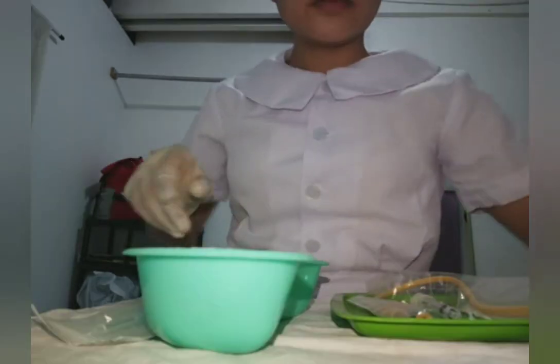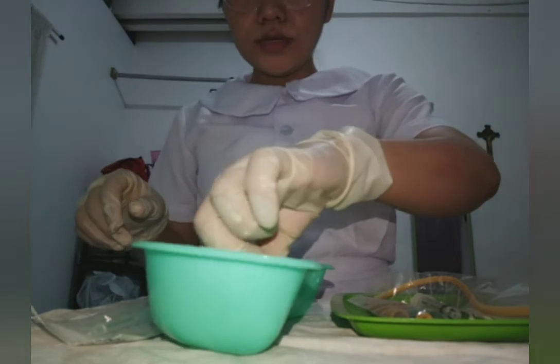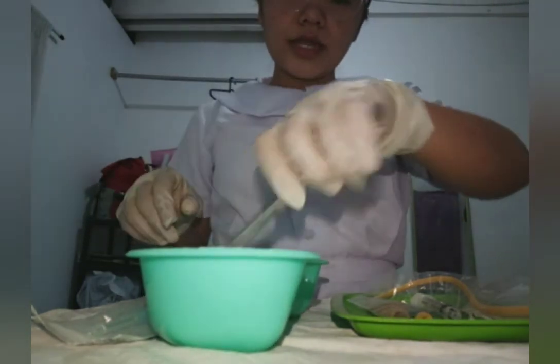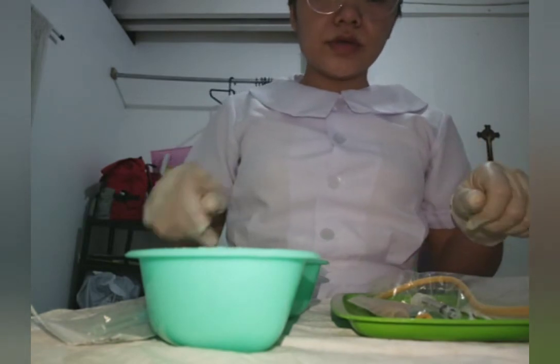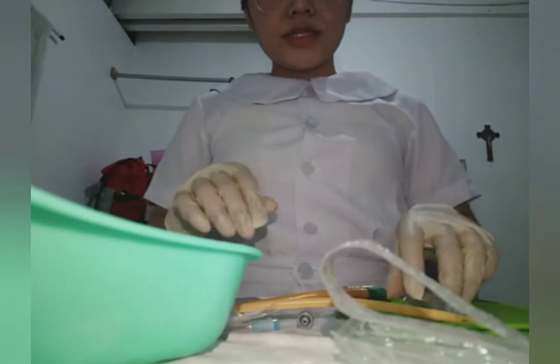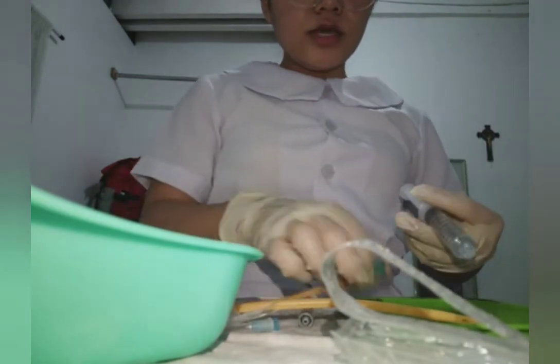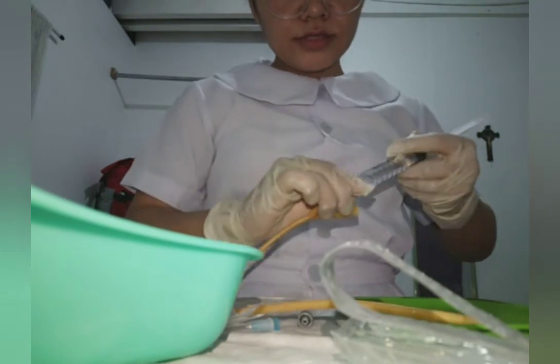Now it's time for the material preparation. First of all, I will prepare the antiseptic solution. I have cotton balls and betadine with sterile forceps. You can also use an iodine swab. After that, I will prepare the catheter. I will attach the saline-filled syringe to the side port of the catheter here, and I will inflate.